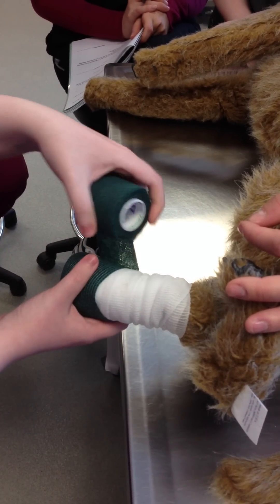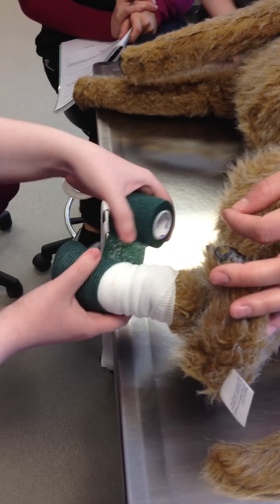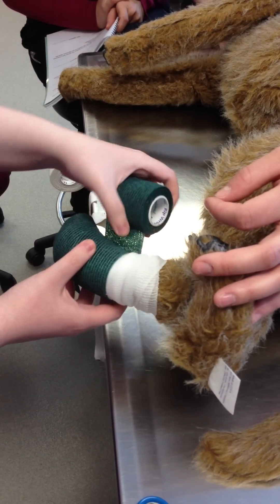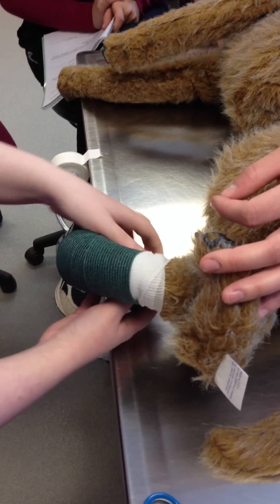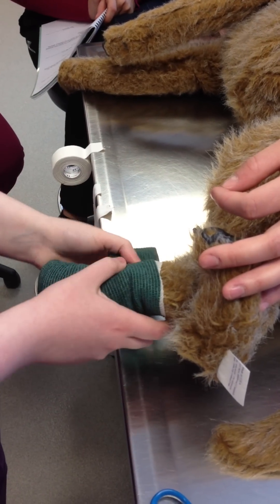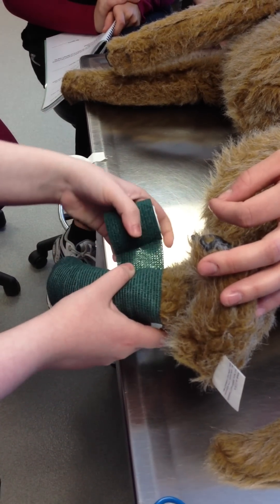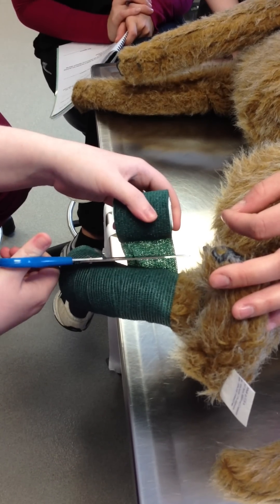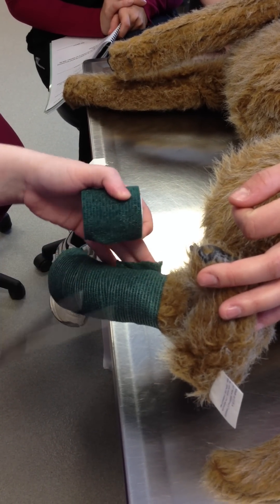Don't forget that his paw's not a normal shape. If his paw were a normal shape, I think you'd find it a bit easier. You're going to practice on real patients today. When you do put this on, I'd like you to try the client-convenient method. You'll find you can make a nice straight border there, and it sort of stops in a natural place as you go up the leg.